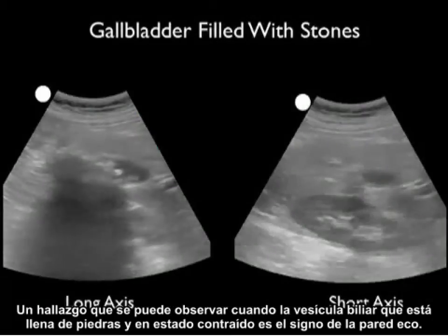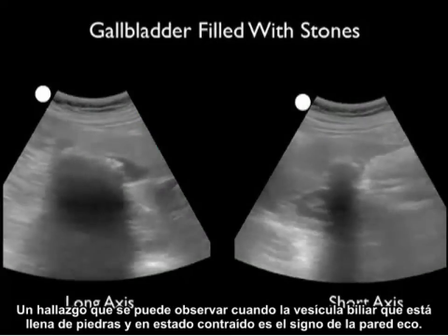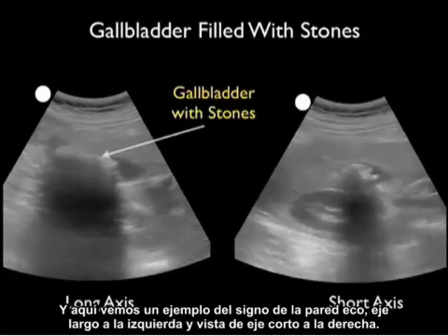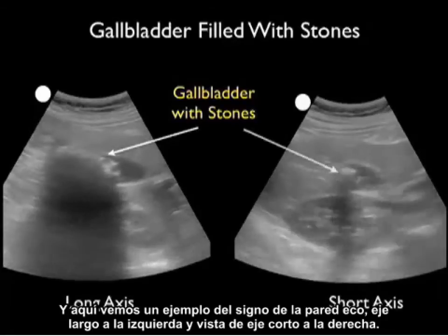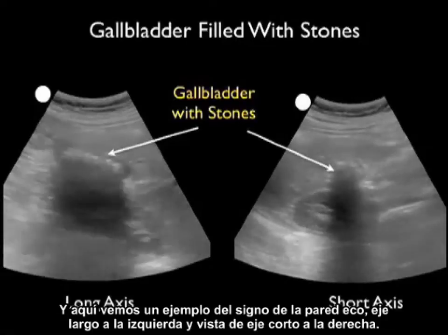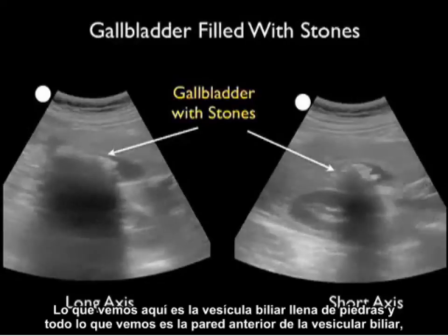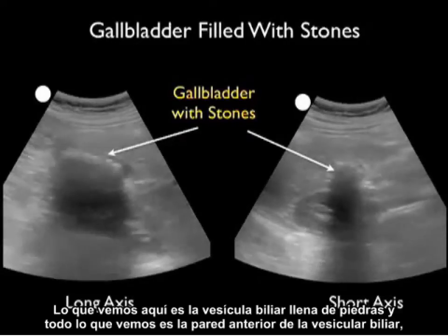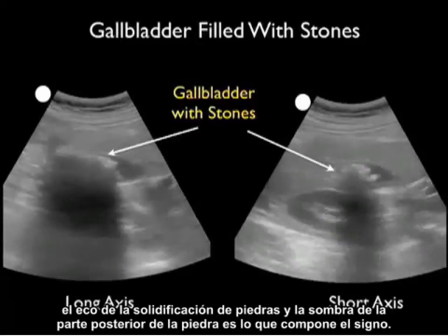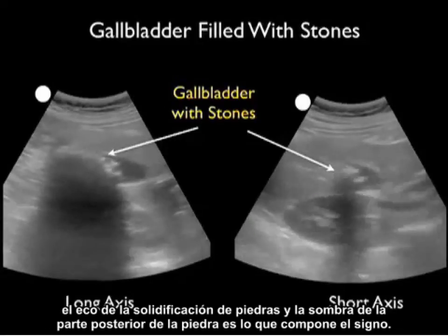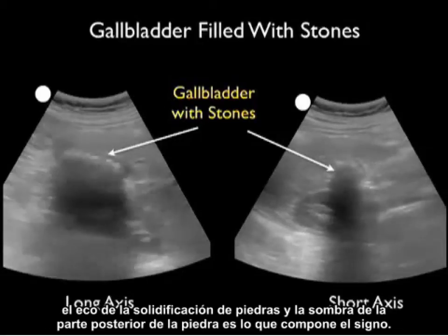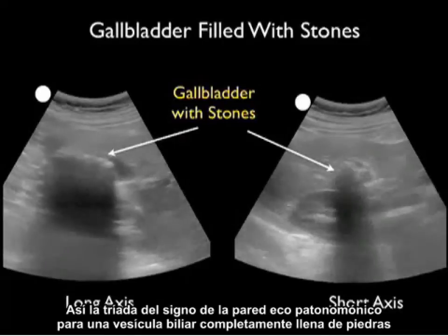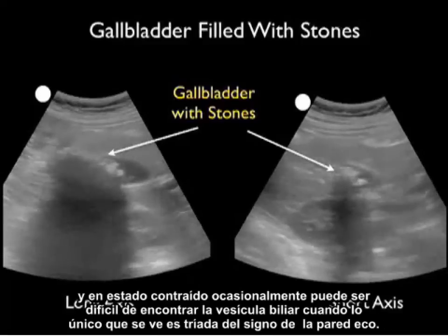A sonographic finding seen when a gallbladder is completely filled with stones in a contracted state is the wall echo sign. We see an example here in long axis on the left and short axis on the right. What we see is the anterior wall of the gallbladder, the echo from the concretion of stones, and the shadow off the back of the stones making the sign. The wall echo sign is pathognomonic for a gallbladder completely packed with stones in a contracted state, and it can occasionally be difficult to find the gallbladder when all you see is this sign.